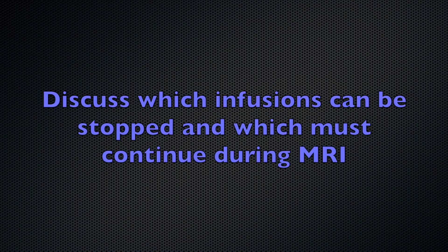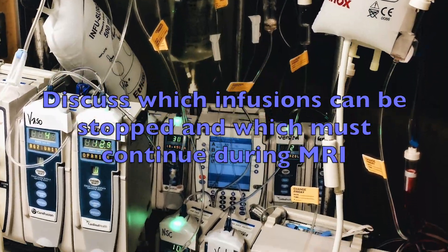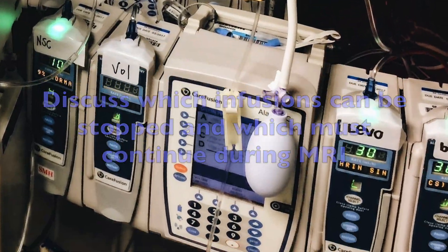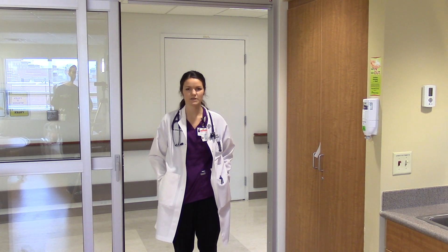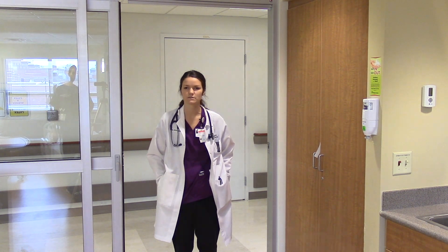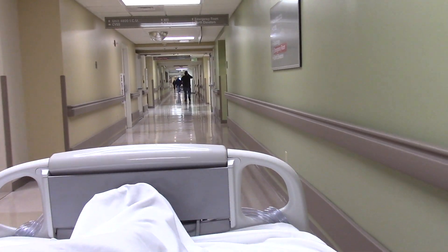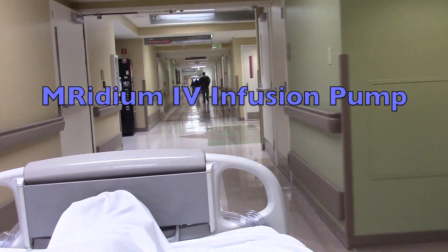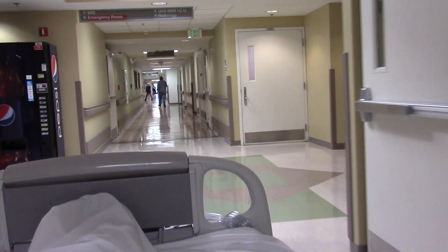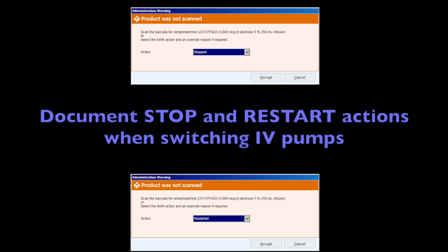If your patient is appropriate for MRI, discuss with the provider which infusions should be stopped and which must continue for the scan. When scheduling the MRI with radiology, inform them that you will need the MRI IV infusion pump. Transferring the infusions from the Alaris pump to the MRI pump must be documented on the MAR using the stop and restart actions. This is considered a new setup.